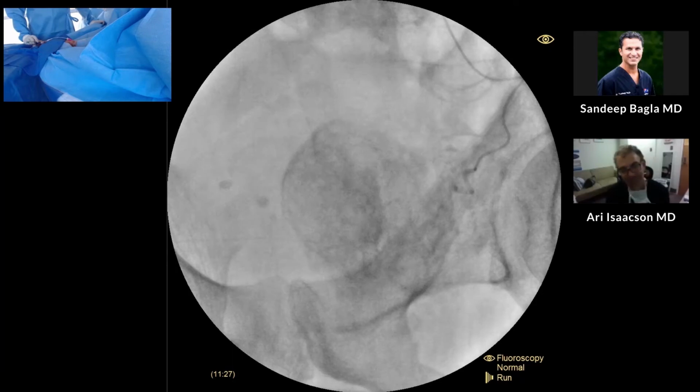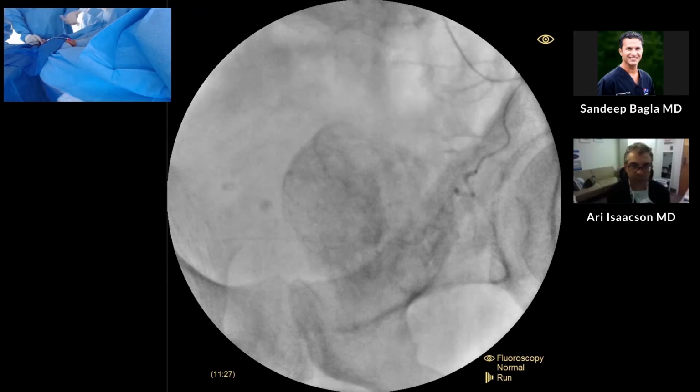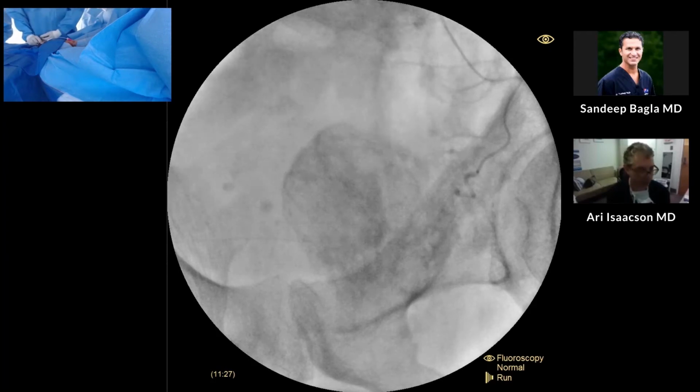Yeah. But I do sometimes prefer to use an 018, and with 018 coils and also with 018 wires, it is nice if you want to go back and forth, because not everybody wants to open up a 2 French catheter every time in the very beginning. Some people may reserve it for a smaller size gland or smaller arteries. How about you? What's your feeling on that? On what size catheter? Yeah.